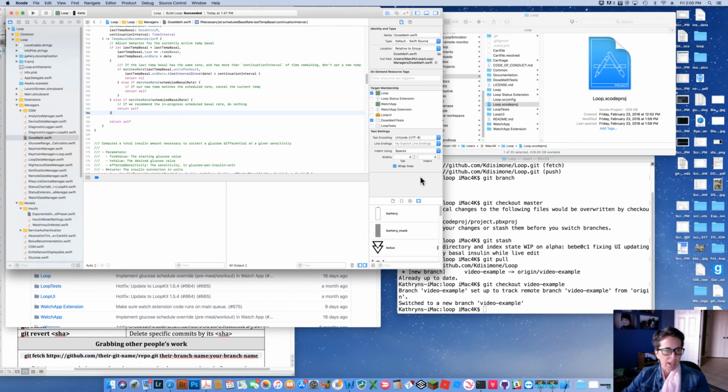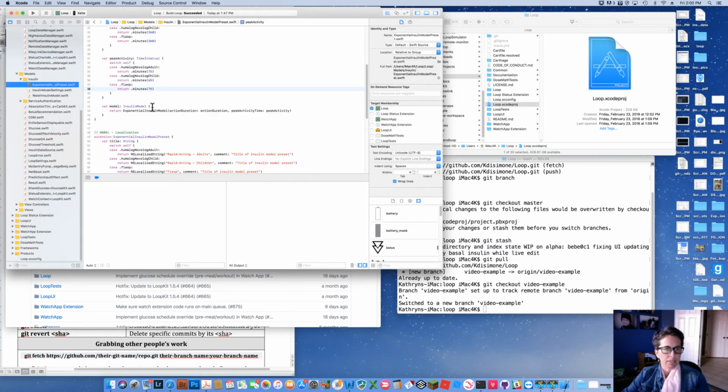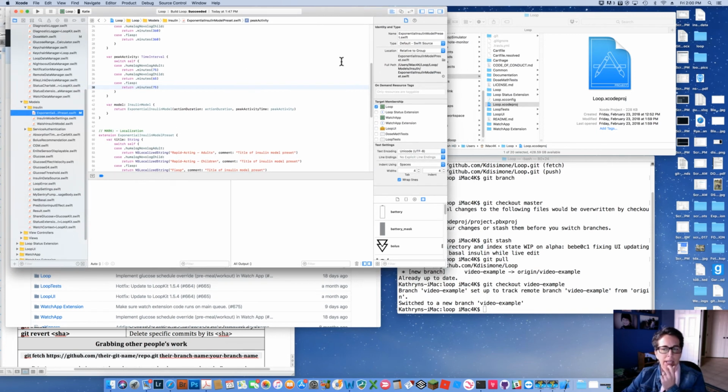That's cool. If I press Command S, it saves the project, but it doesn't commit these modifications to my Git repository. It hasn't saved them. So I can see that they're modified with this M, but not totally committed. So how would I do that? Committing basically saves them into the Git history. It's the tracking mechanism for all changes.